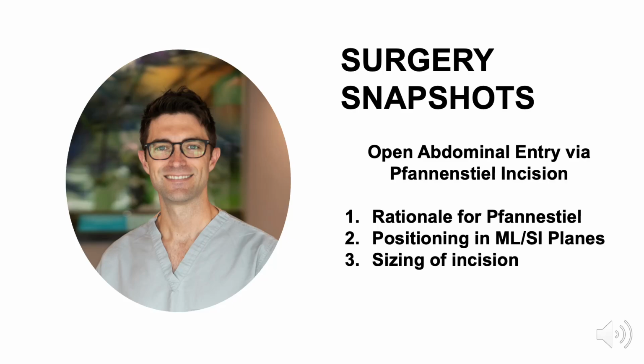I am a surgical oncologist at Baylor College of Medicine, and in this short video, we'll be talking about the open abdominal entry technique using a Pfannenstiel incision for colorectal procedures. There are three main purposes to this video. The first will be to discuss the rationale for using a Pfannenstiel versus other incision types for open entry. The second will be to discuss positioning considerations for the Pfannenstiel in both the medial to lateral and superior to inferior planes. And then finally, I'll talk about sizing of the incision.